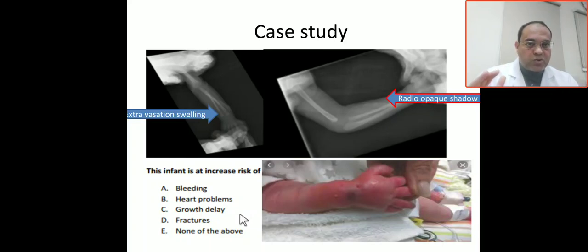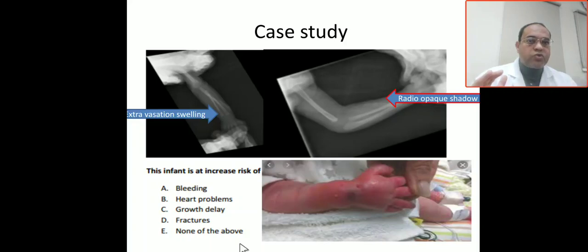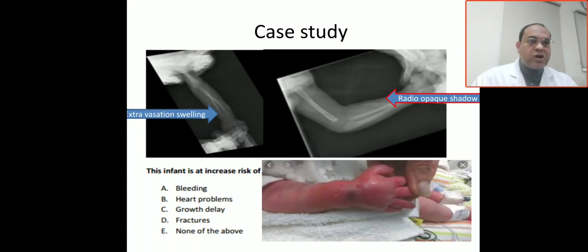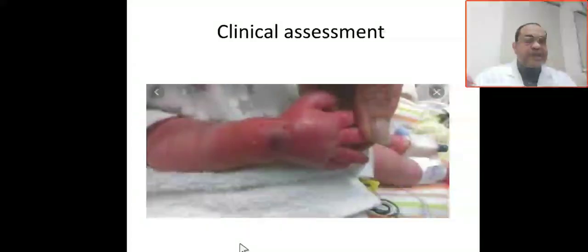Fracture is also not the case. So the answer is E — none of the above. This case of radio-opaque shadow due to calcium infiltration and extravasation is not associated with bleeding, heart problems, or gross developmental delay, because all of those would be associated with TAR syndrome, Holt-Oram, or Fanconi anemia.